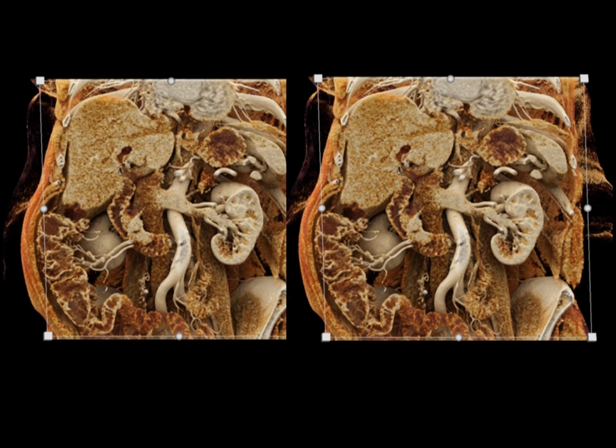Question, will cinematic allow me to pick up that duodenal tumor better? Here it really stands out when I show it to you. The question is, I could have seen it on the coronals, the routine coronals, but will I do better if I use cinematic? And I'm beginning to think the answer will be yes, because it will be optimizing a way for lesions to be visualized. It may also prove to be one of the directions we all go in deep learning. So that will be very, very interesting. And here again, just very nicely, the duodenum and the different texture of the patient's tumor.